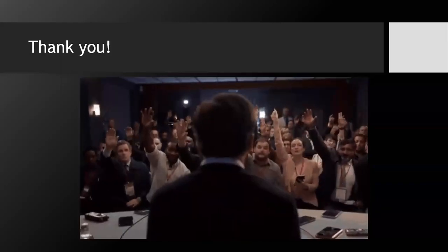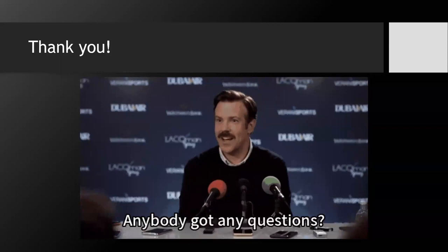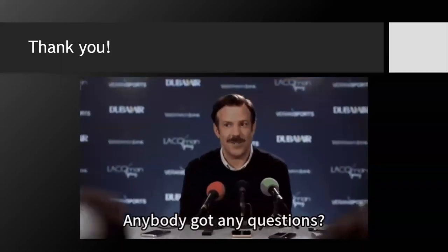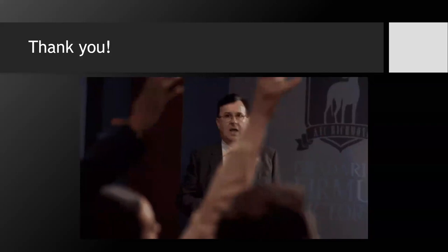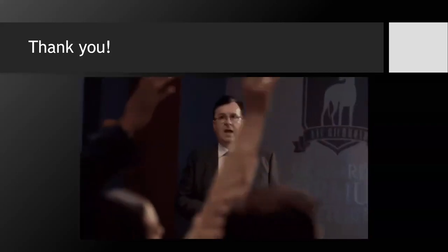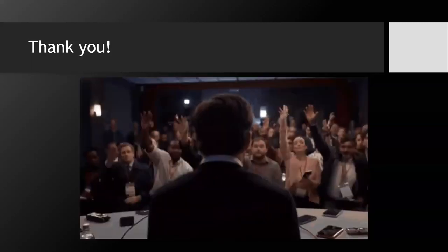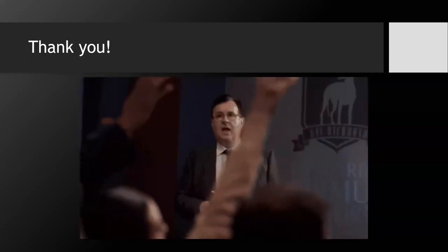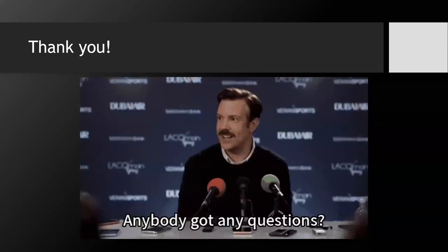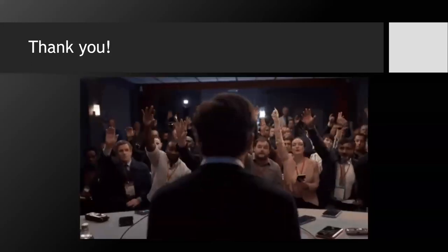One other quick question too. So would your suggestion be, if you calculate it multiple times, I think you've said before too, you shouldn't be able to overestimate this. Is that right? So the higher value in theory should be accurate. Yeah, if it's a good envelope. So you could overestimate by overtracing. But if your envelope is in a patient in normal sinus rhythm, your best envelope will be at your best angle.